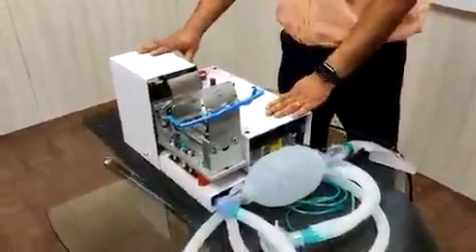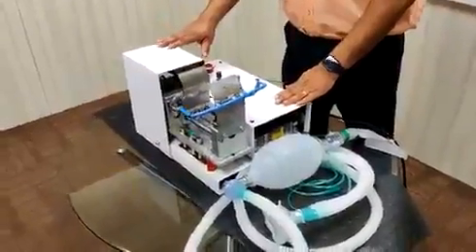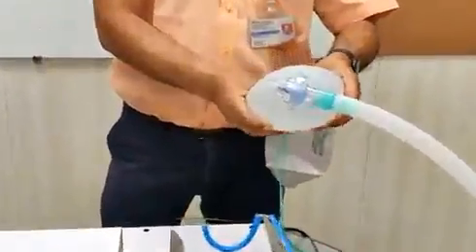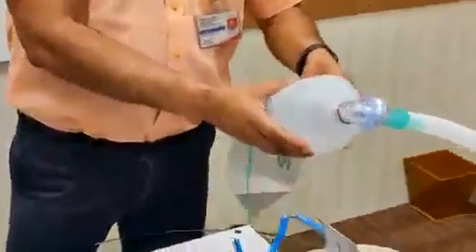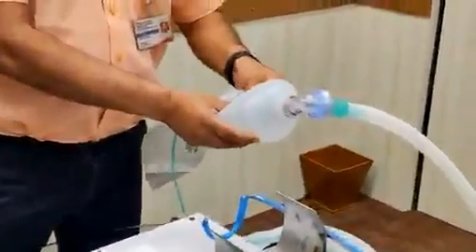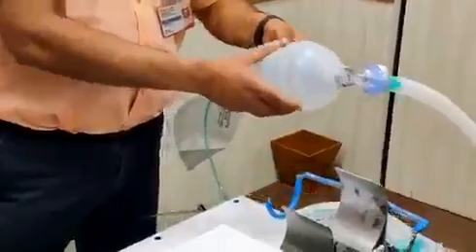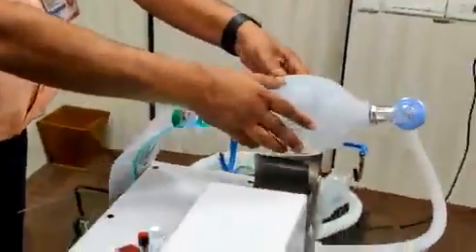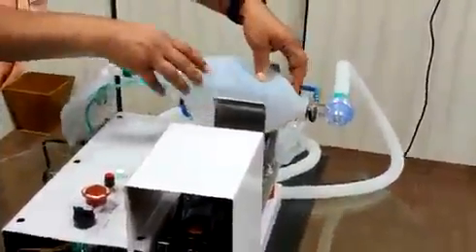We have developed a mechanical device for operating the BVM bag. The BVM bag is currently being used by medical practitioners in emergency cases by operating it manually. As the pressing is manually done, it cannot be sustained for longer durations, and in current circumstances, distancing from the patient is very much necessary. So we have motorized the pressing operation with all the necessary controls.